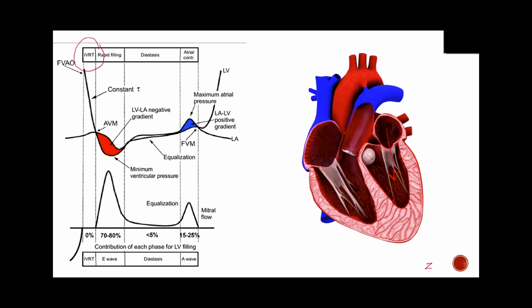So what we can see on the left side of our screen is our mitral inflow pattern. So this is the velocity of flow going past the mitral valve. But there's a period during diastole here in which there's no flow. And that's just because the ventricle is relaxing during that time, but the valve remains closed. All right. There becomes a point at which the left atrial pressure is high enough that it opens up that valve and flow starts. Okay.